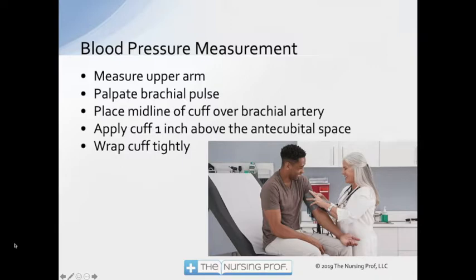If I am measuring in their wrist and this person has some significant atherosclerotic disease, it's not as likely to be as accurate. So if I'm really concerned about this patient's blood pressure, I'm going to measure it in the upper arm using the brachial artery. Notice as she's doing right here, that we're measuring the blood pressure on the left side — because the left arm is closer to the heart. We're trying to find out what the pressure is at the heart level, not in the fingers, because that tells us about our hemodynamics and the cardiovascular system as a whole.